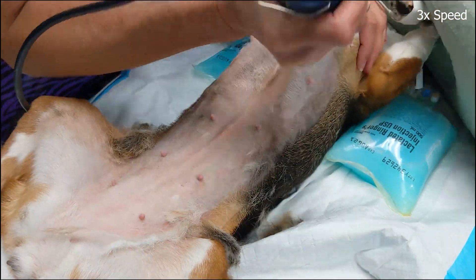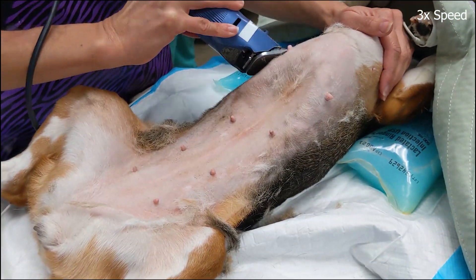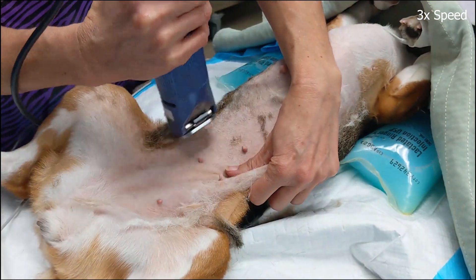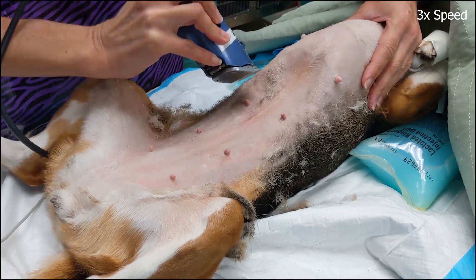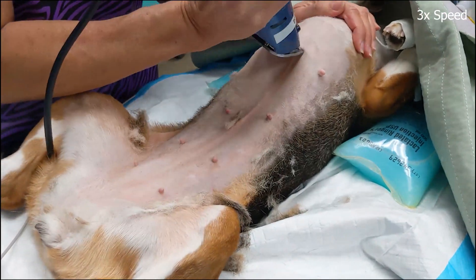To get a close shave without cutting the skin, the hair is first clipped in the same direction as the growth pattern, and then once it's a little shorter and more manageable, it's clipped against the grain. Stretching the skin with your opposite hand will help decrease the risk of clipper trauma.